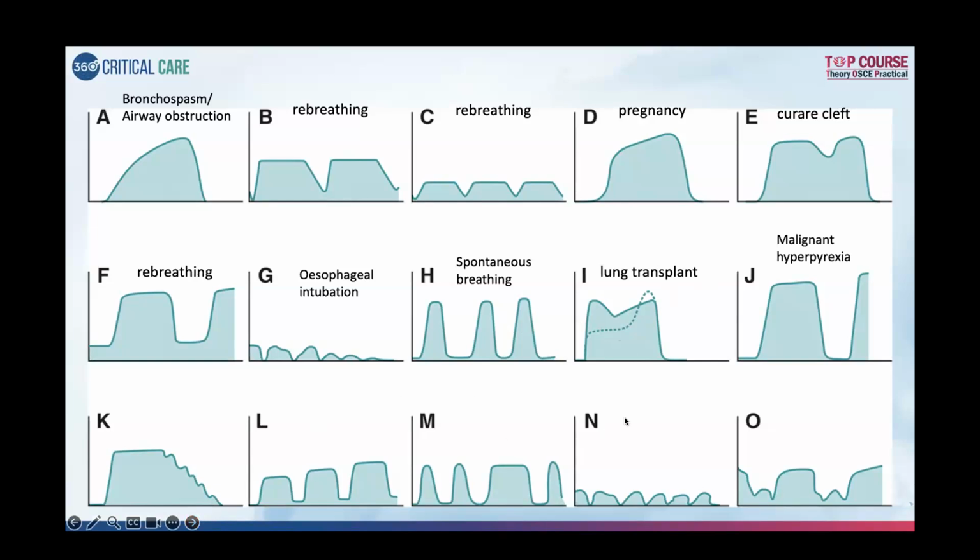Malignant hyperpyrexia, just based on the number, where you have a higher EtCO2. Malignant hyperpyrexia or fever can cause these things, or a hypermetabolic syndrome. Cardiogenic oscillation: you can get these oscillations transferred with the air going out. With each cardiac contraction, you will get some sort of exhalation, so that is suggestive of that.